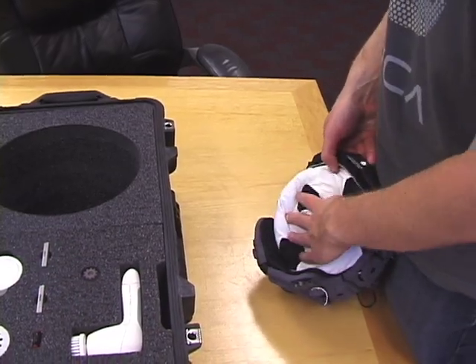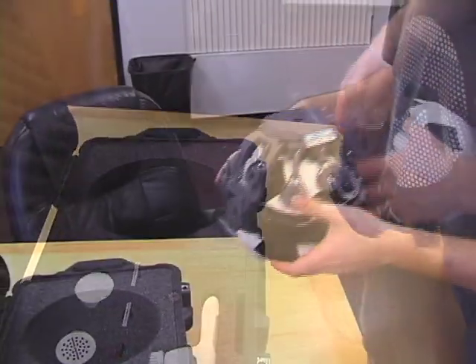For storage, stuff the supplied padding into the headset and return it to the protective case.